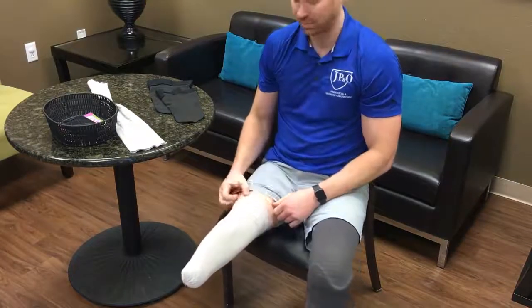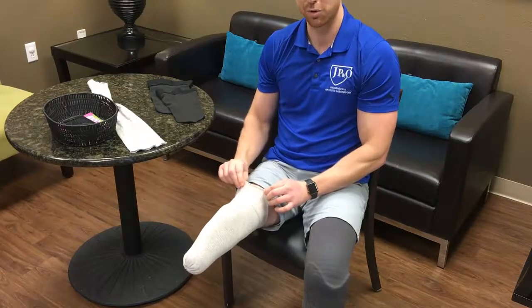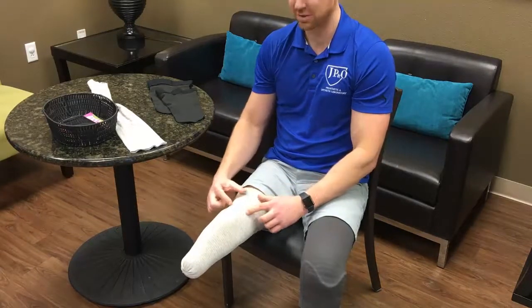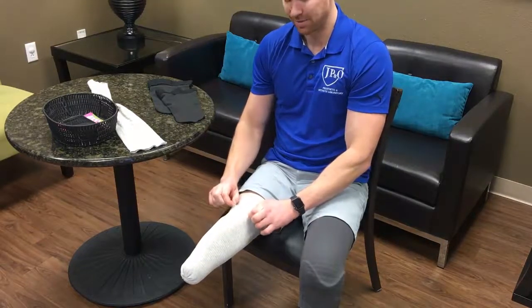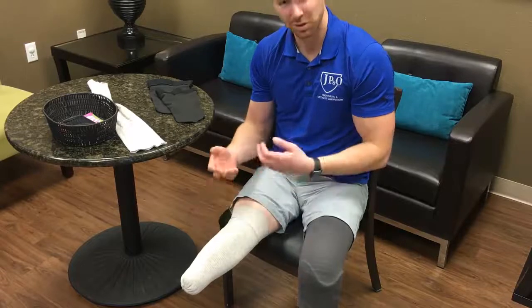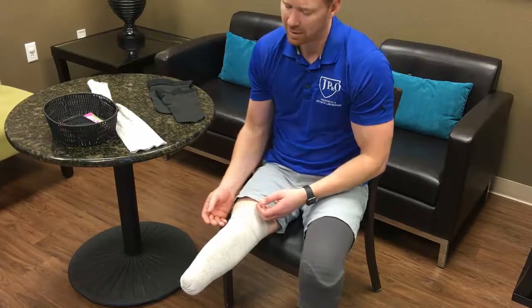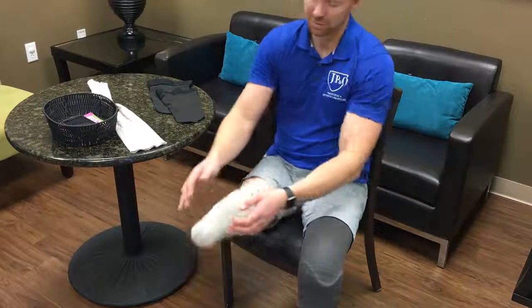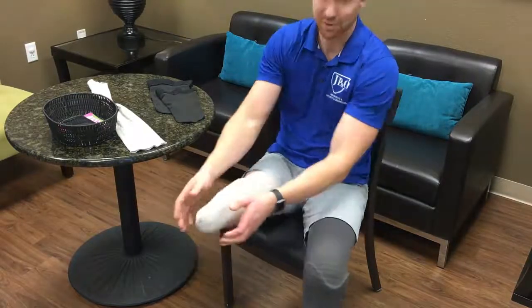And always be mindful that your first layer or your base layer is about 2 inches higher than your second layer. Because if you don't, it can create a tourniquet effect, which cuts off the blood supply. When you get done donning your shrinker sock, make sure all the wrinkles are out of it, and you're done.